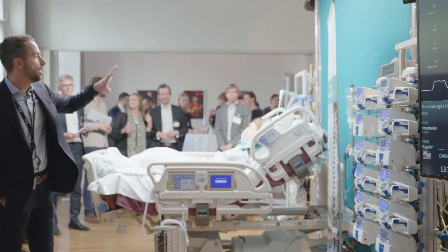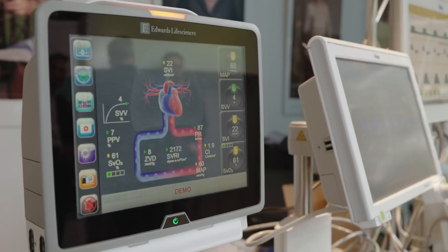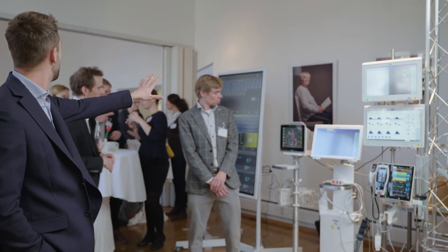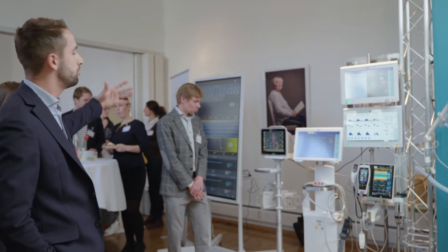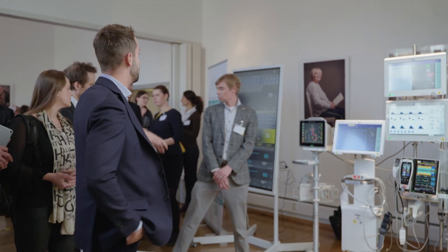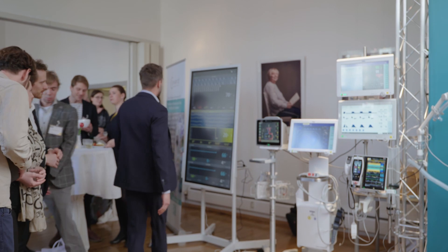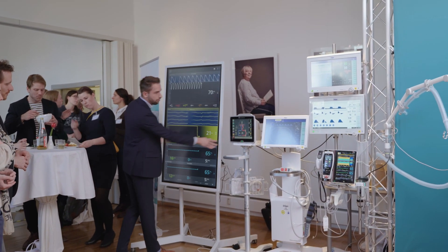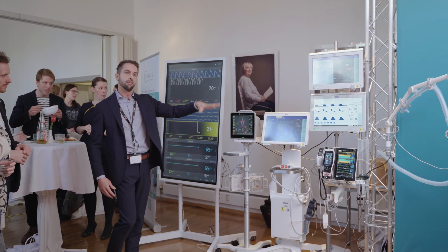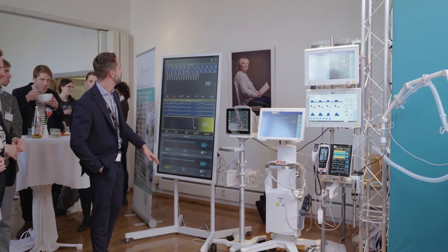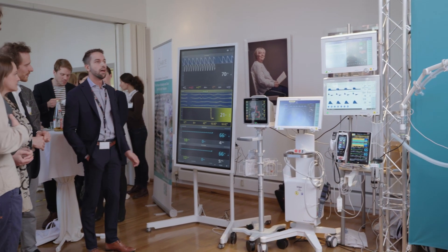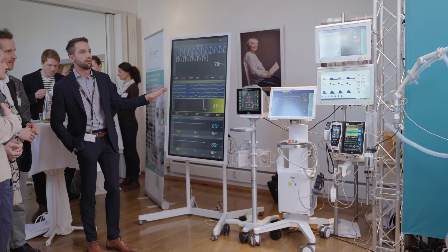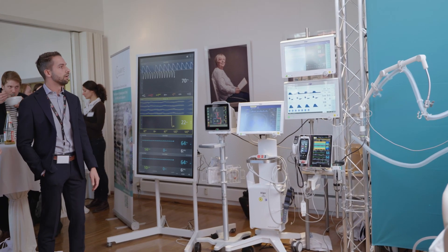All of those devices are connected directly to our root monitor over there. The second option is to get an additional display on a bigger screen right here, which allows you to see exactly what you have on the root monitor, and get all the parameters that are currently being measured on this patient. Thank you.